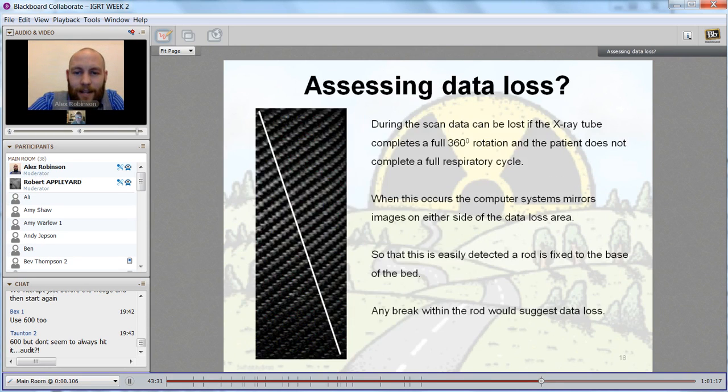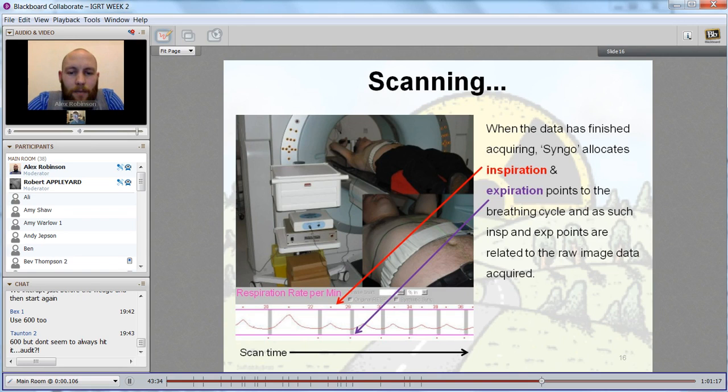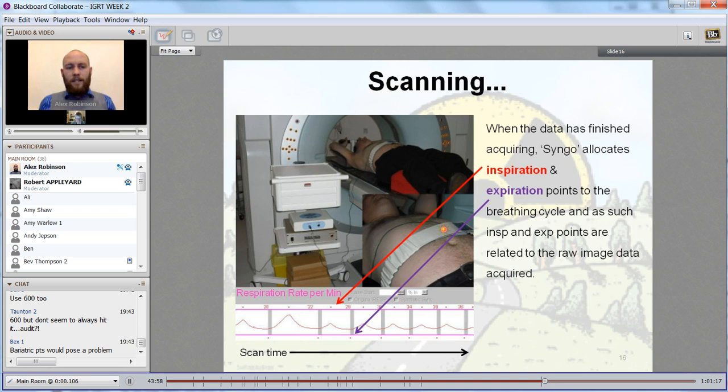Okay, so let's try and find our slides here. On this slice, Rob, we've got this elasticated band that goes around our patients. What we tend to find is that as our patients' body mass index starts to increase, you really struggle to see the diaphragm and abdominal motion due to breathing, because we've got both external fat and internal fat, which is pushing our lungs really superior. So sometimes we really struggle trying to find this tracer, this thing at the bottom.